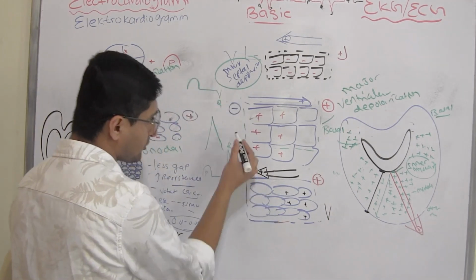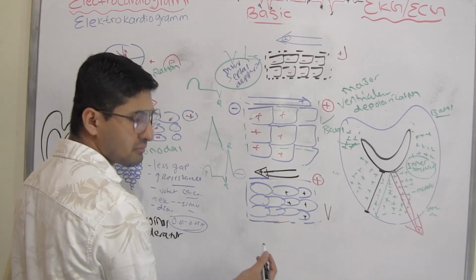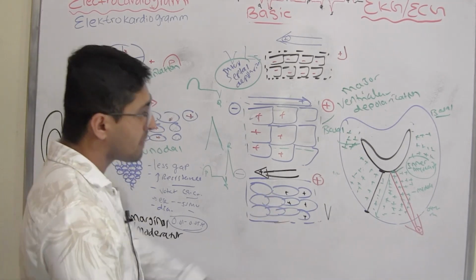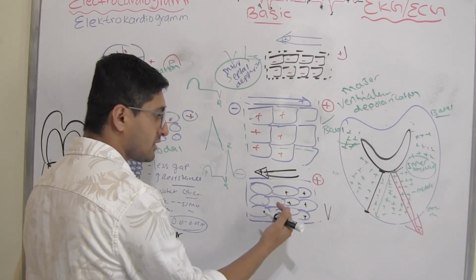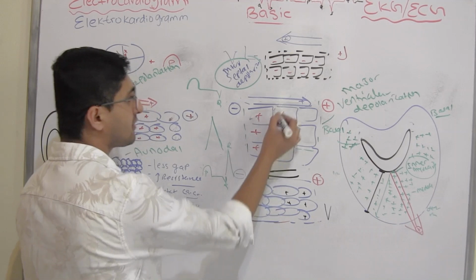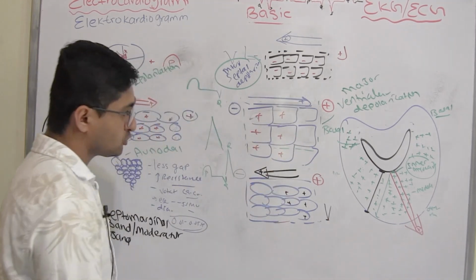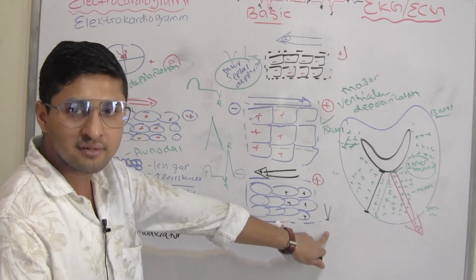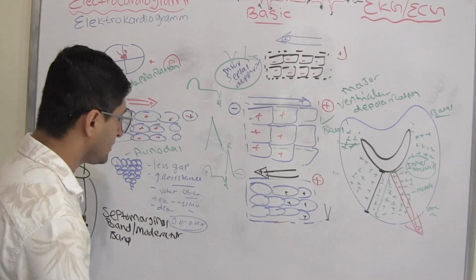But if you compare to the septum, because these are ventricular myocytes, right? They contain Purkinje cells, but not as much as the meaty ventricles. So because of that, it will have a stronger deviation, but not as big as this one. So it will be between that. So you have something like this. So you have downward, the ECG reads as negative, so there are negative deflections. Isn't this easy? This is shockingly easy.